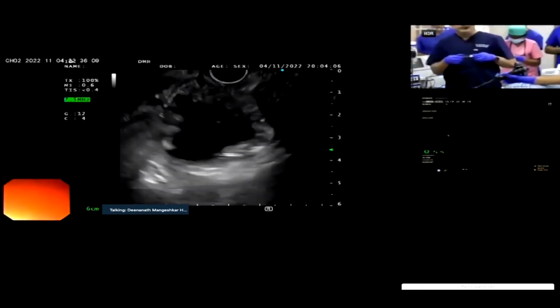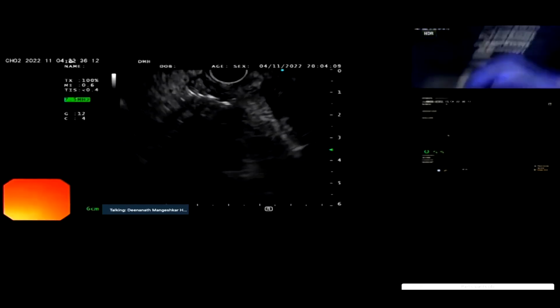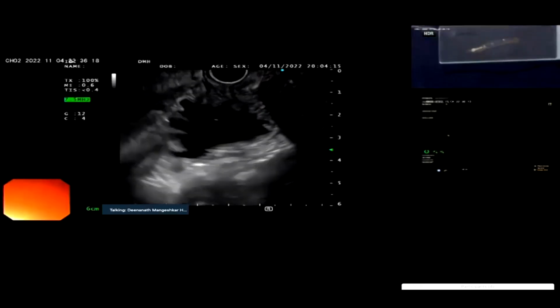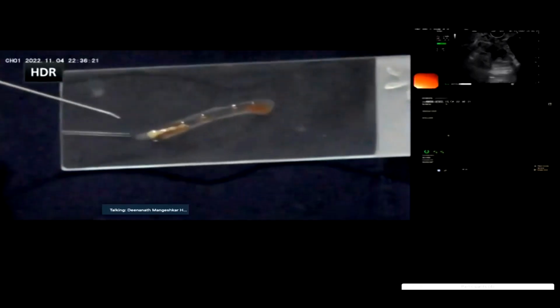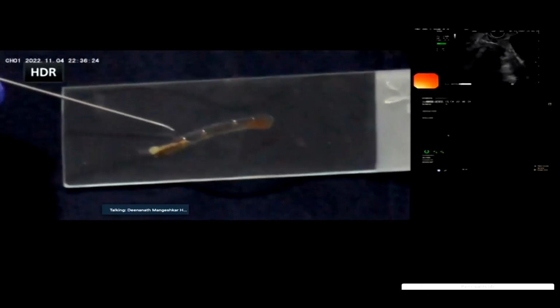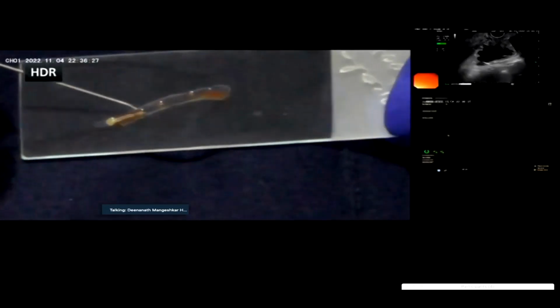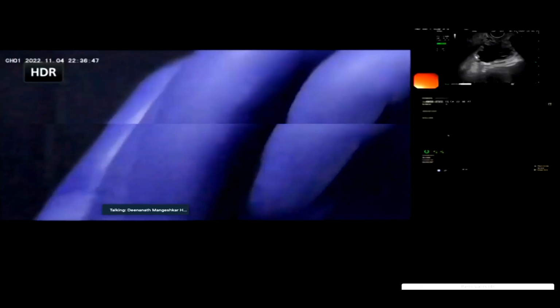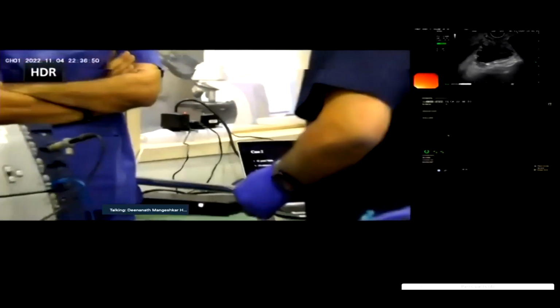Now, give the external camera please, and you can try and zoom in completely. Can you see this? Yes, sir. You see the white tissue in between the red. That white tissue is actually the pancreatic tissue. So this is macroscopic on-site evaluation. This is what you can see as adequacy of the sample. I don't know how much zoom is acceptable by our camera, because we don't have our microscopic camera today because of the time. So we will send this for cytology.